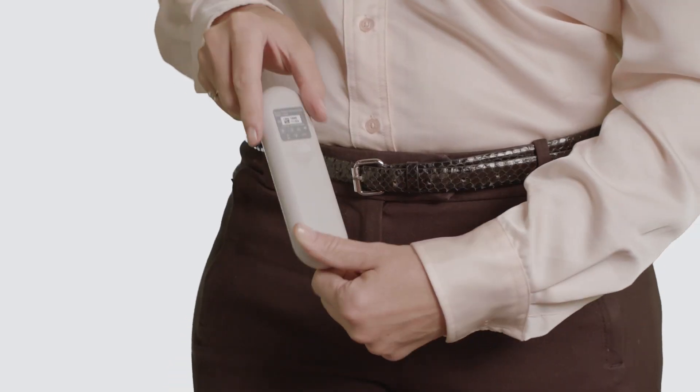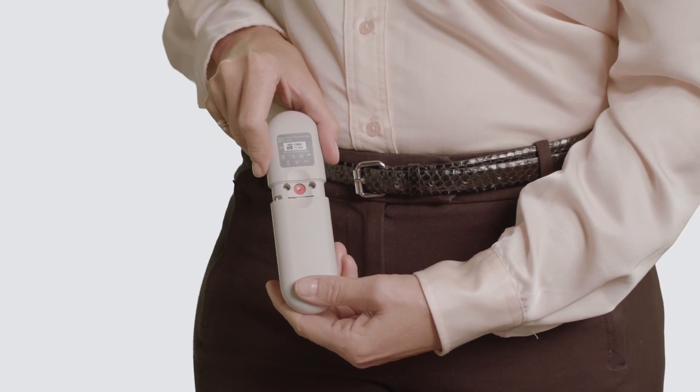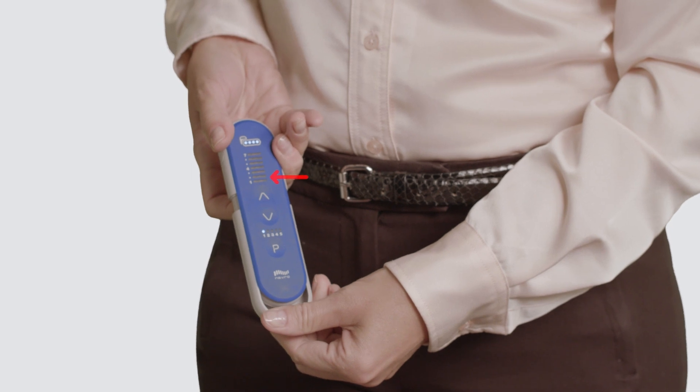Once the remote is on, slide the battery cover of the remote open just enough to expose the red stimulation off button. Press and hold the red button for at least 10 seconds. While holding the red button, the remote will beep and the illuminated numbered levels will turn off, confirming that stimulation has been turned off.